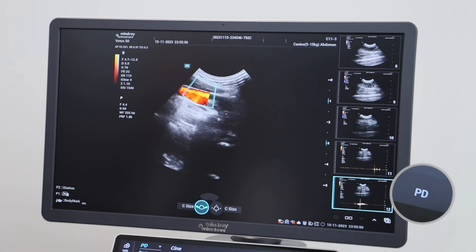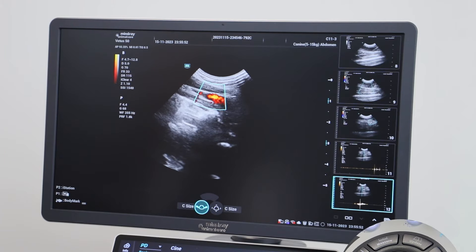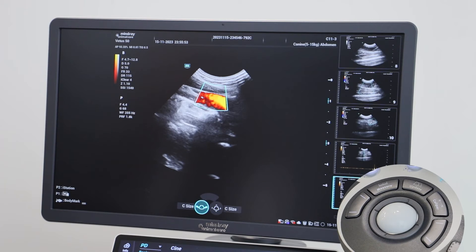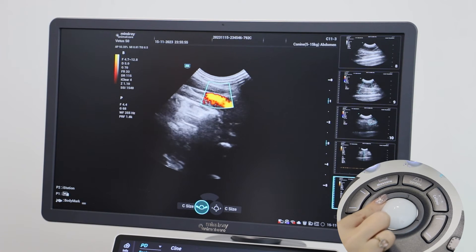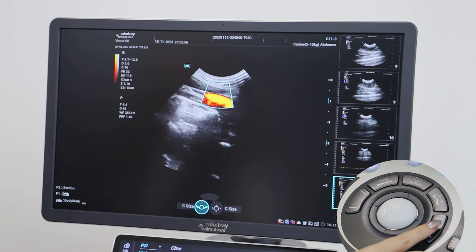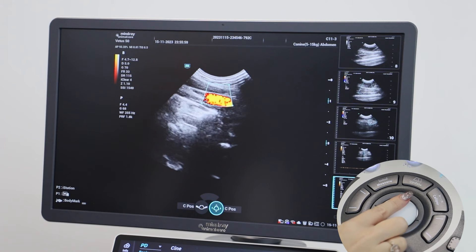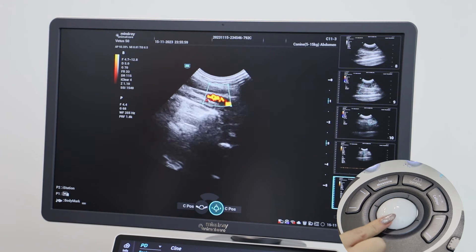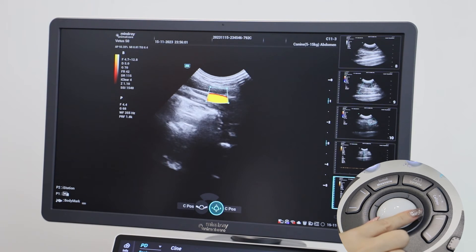To move the region of interest around, move the trackball. To change the size of this area, tap on the trackpad and then adjust. Click the trackpad again to set the size of the window.